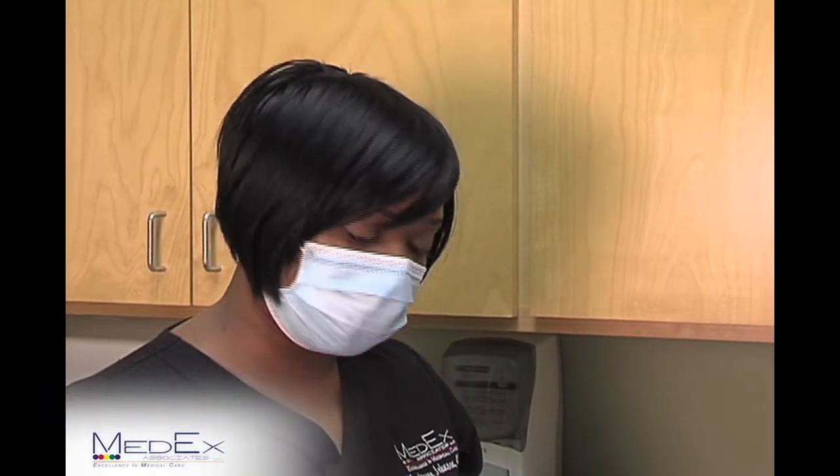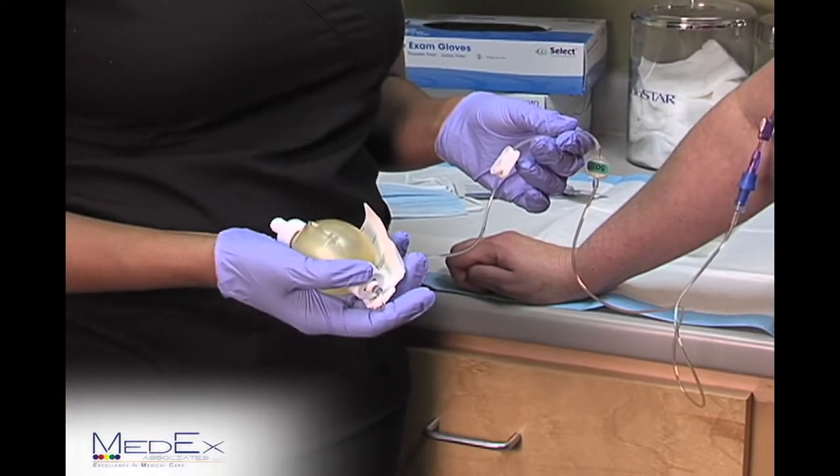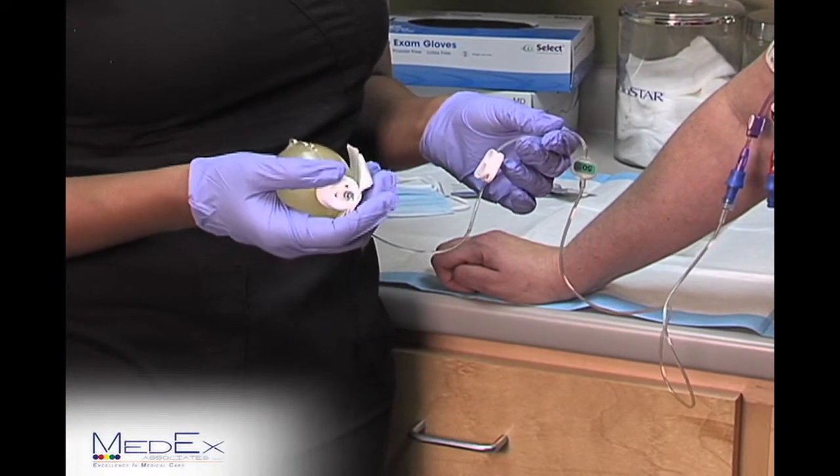At this point, your infusion will begin. Remember, you can keep your antibiotic in your hand or in the chair beside you. It does not have to be above the level of your heart.